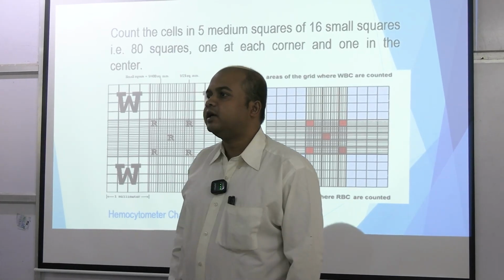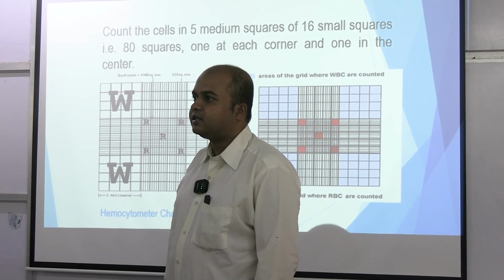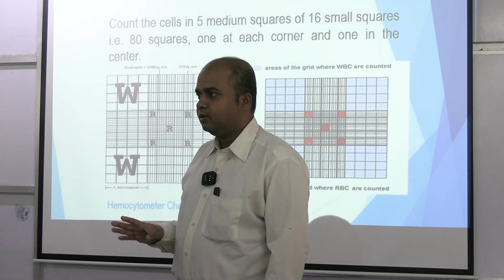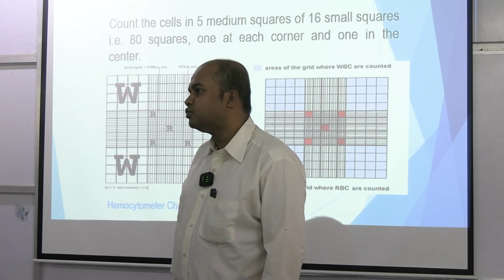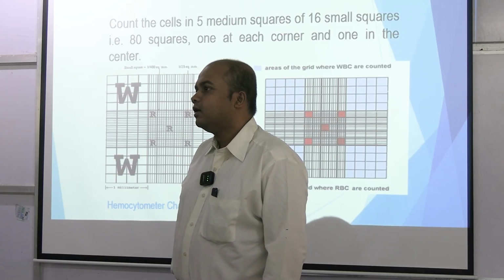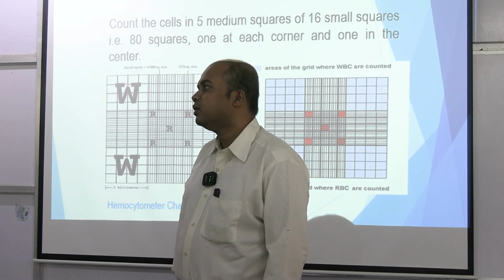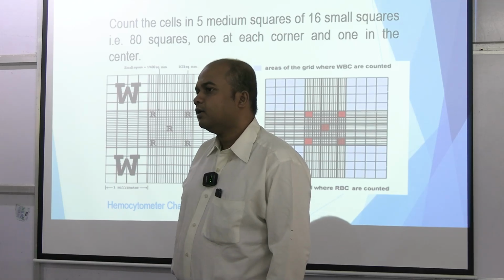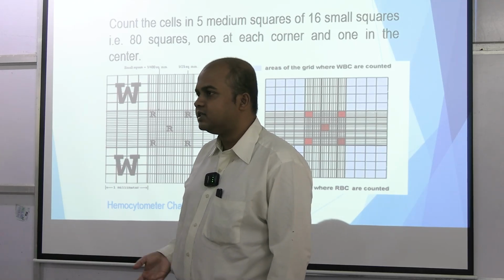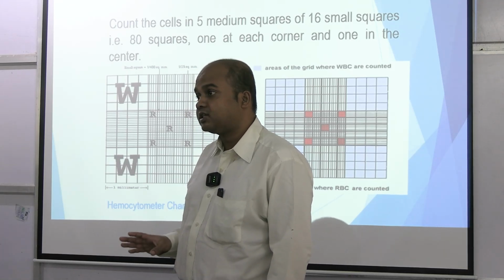So say it is 8,000, then x should be, if it is between 4,000 and 11,000, between 80 and, for 11,000, it has to be 220. So between 80 and 220, but this is just back calculation. So x is to be expected like that.